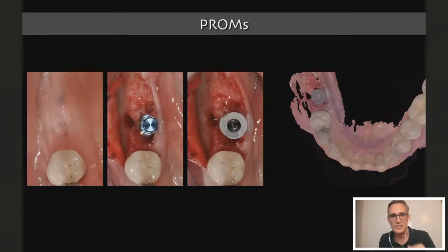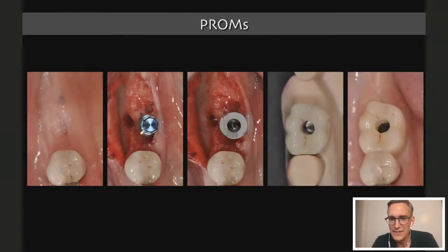Exactly. And the other one is that Irena Seiler was already showing in her Just Ask session that we could take impressions at the time of implant placement. I know that it could also be done with a conventional impression, but it's much more hygienic to just take an intraoral scan because you don't touch the tissues. That's a new workflow. When we have the digital scan, the dental technician can already start with the fabrication, and once the implant is integrated, everything is ready. And actually, we can save 1 appointment.